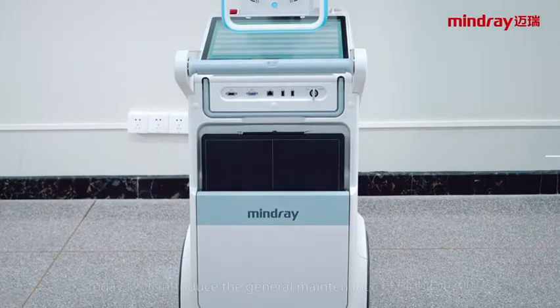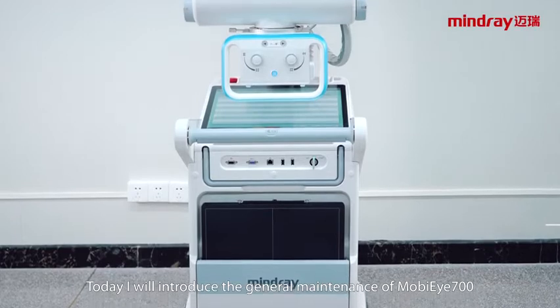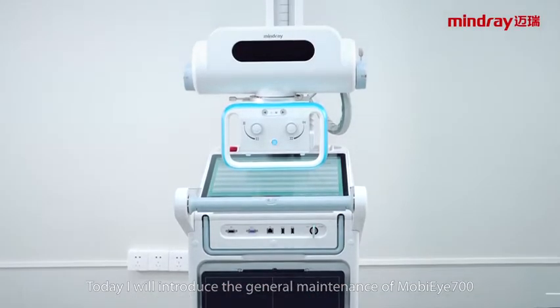Hello everyone, today I will introduce the general maintenance of MobiEye 700.